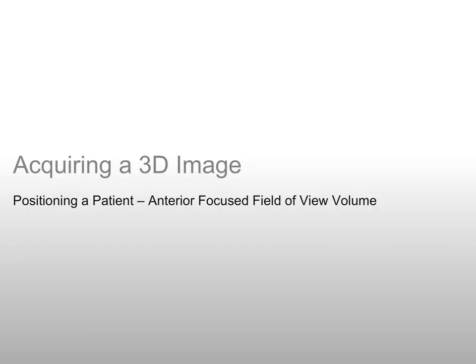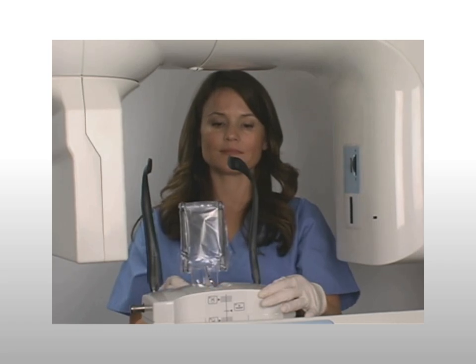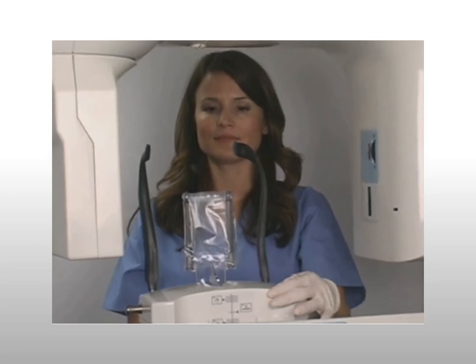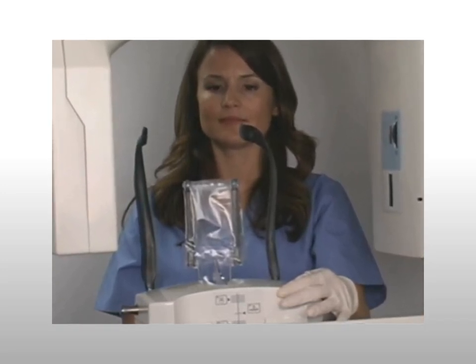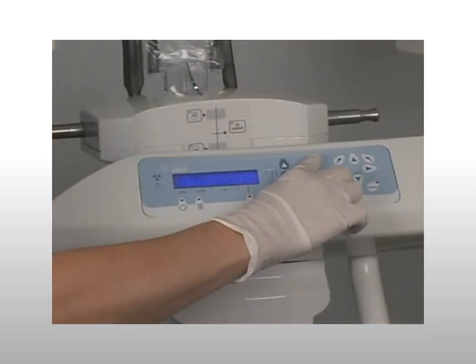Acquiring a 3D image: positioning a patient. Next, we will position a patient for an anterior focused field of view volume. Insert the 3D bite block into the chin rest block — a click indicates it is locked into position. The bite block method is recommended for a localized dental exam, focused field of view volume.